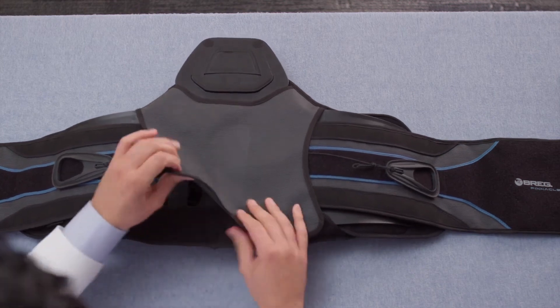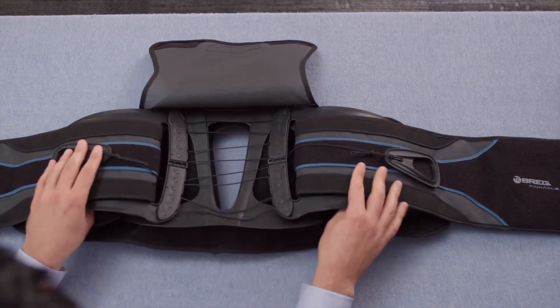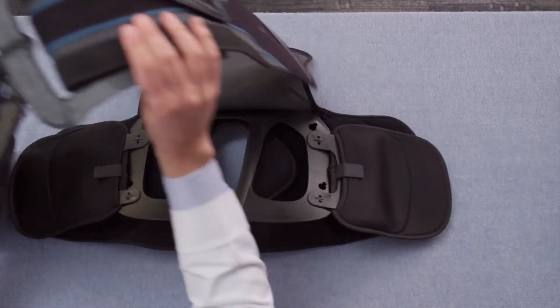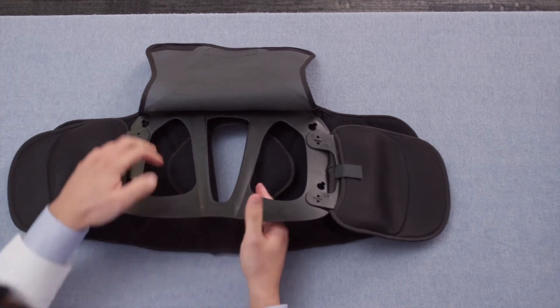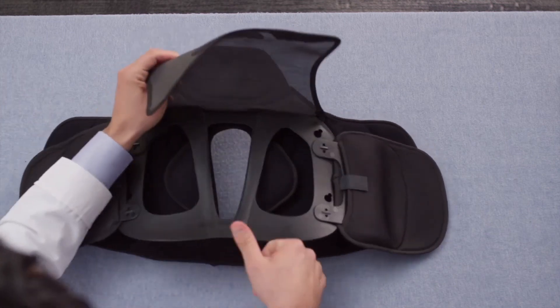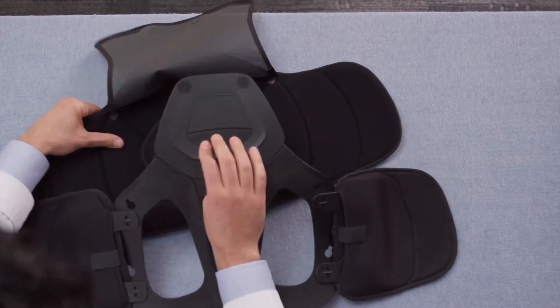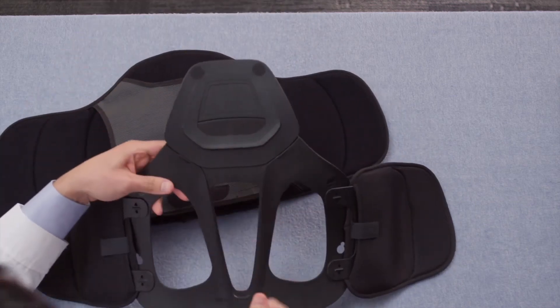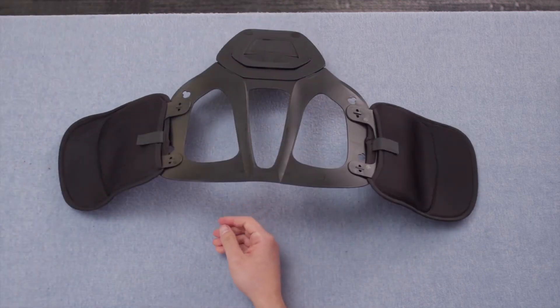Next, lift the back cover and fold it out of the way. Pull the waist belt assembly out and set it aside. Take the back plate assembly and disengage the hook and loop dots at the top of the plate from the loop material on the back pad. Pull it out and set it aside. Discard the used back pad.